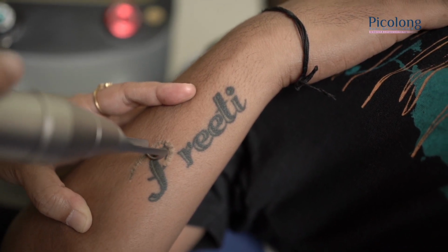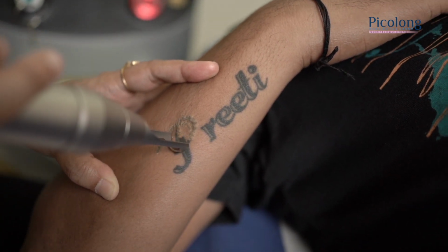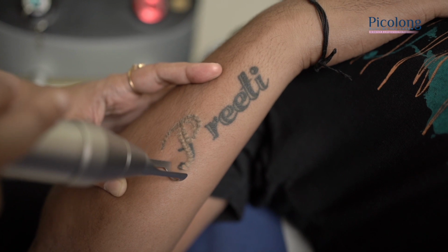So this is the end point. You can see the edema as well as the color disappearing. Focus on the pigment and give 1 or maximum 2 shots in one place. You can go along the pigment.